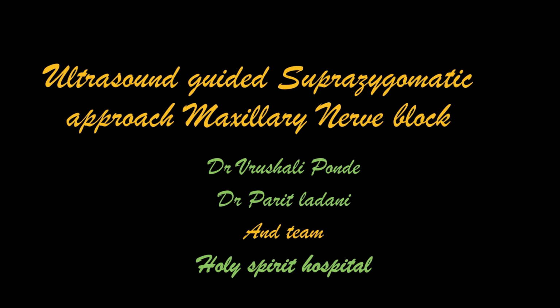Welcome to the fascinating world of pediatric regional anesthesia. Maxillary nerve block imbues profound analgesia for cleft palates and lip surgeries in infants and children. Furthermore, this can be used for many other indications as well. Here is our take on suprazygomatic maxillary nerve block with ultrasound guidance.